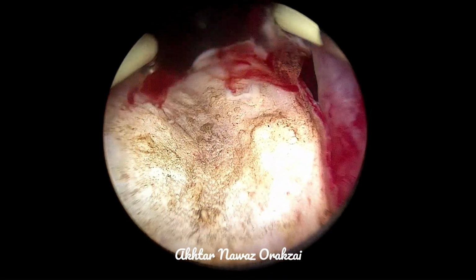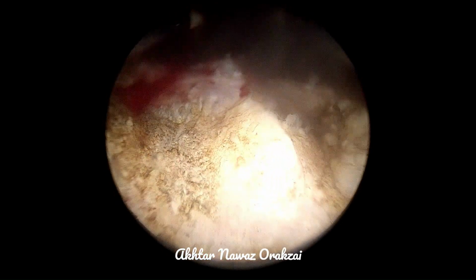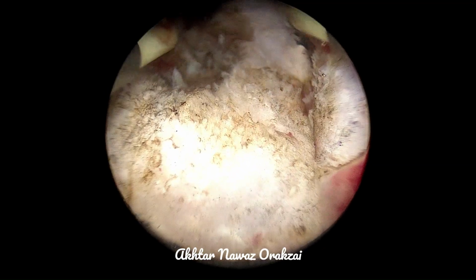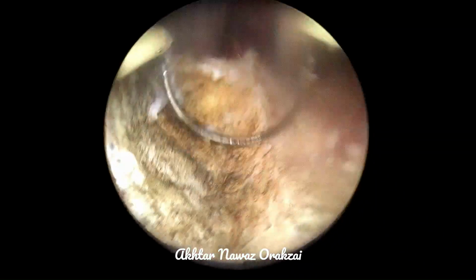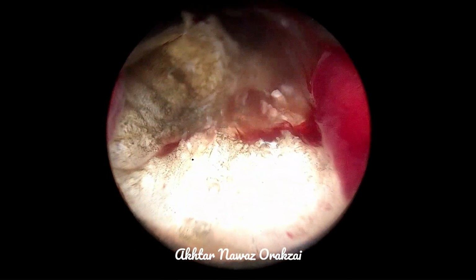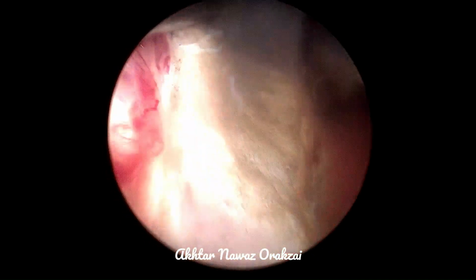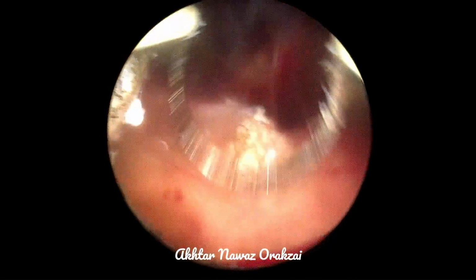In the transurethral resection, we first resect the median lobe and we make a crater so that the inflow and outflow of the fluid during the procedure is uninterrupted and the vision remains good. The key to successful performance of the transurethral resection is good visibility. So for that visibility, flattening of the median lobe, making a crater, is important.